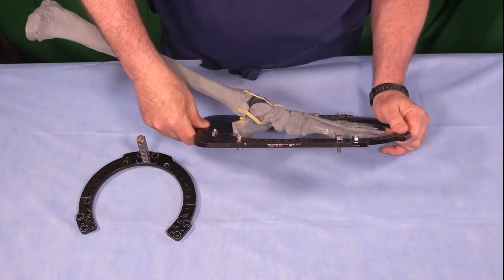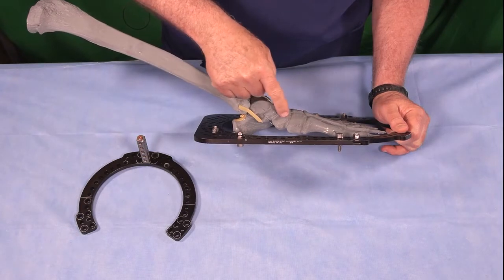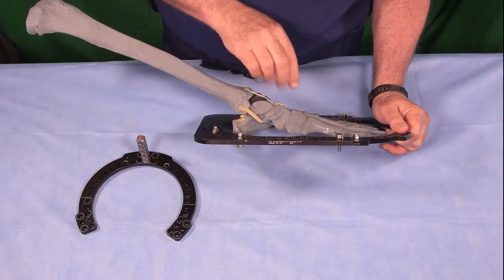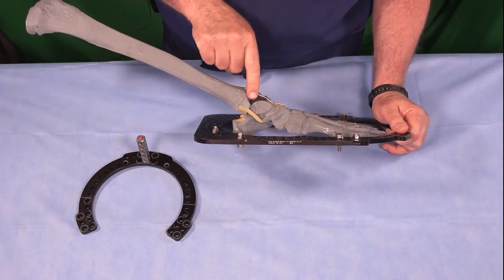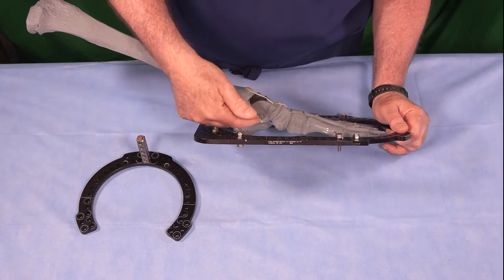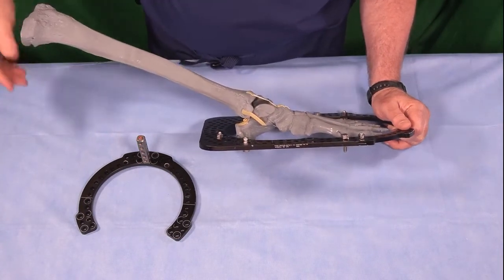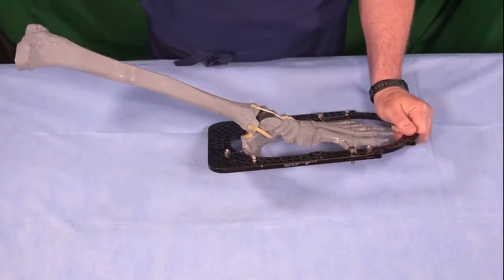Later, after we know where our struts are, we may add a wire in the midfoot and a wire in the neck of the talus to stabilize the foot as a unit in order to focus all the forces on the ankle joint, because that's where we want our distraction to take place, not in the subtalar joint or in the midfoot joints. But for now, I'm going to direct my attention to the tibia.